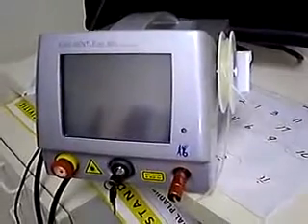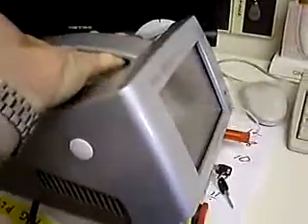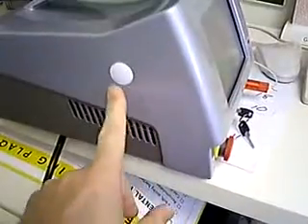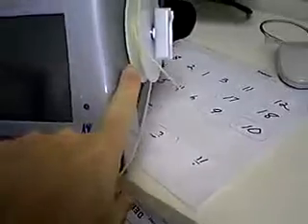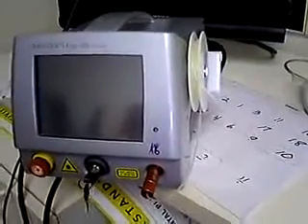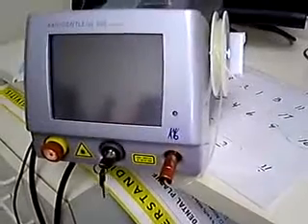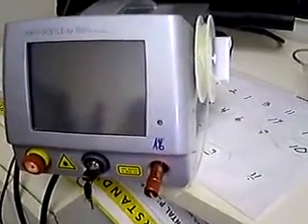Here is the KaVo 980 laser, the Gentleray. It's a pretty compact unit — it isn't very heavy and it's simple to carry in one hand. It also has this white piece here, which means you can take the fiber spool and place it on either side of the unit. It does have a corded foot pedal, and it's not difficult to move around.